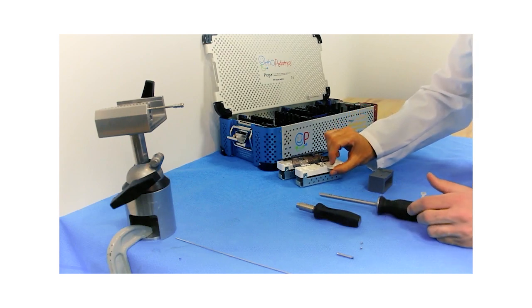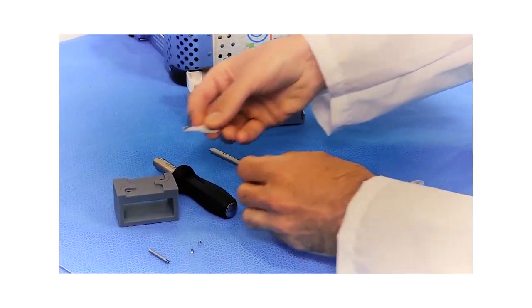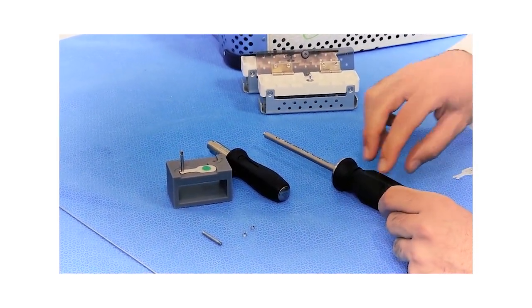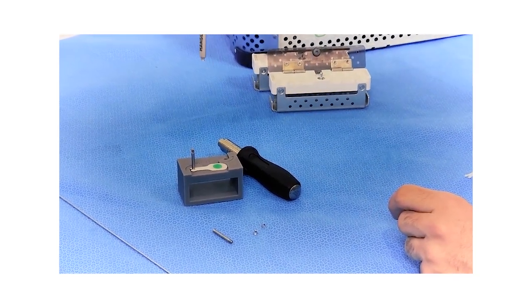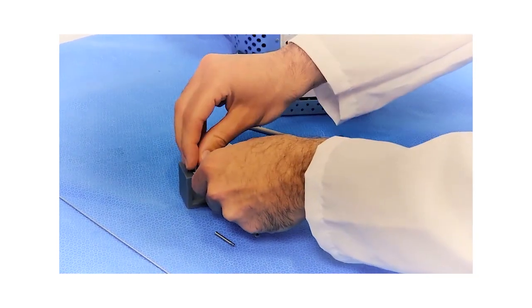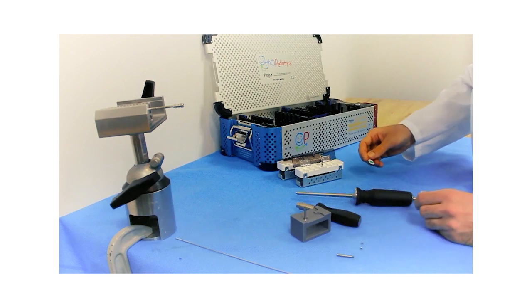Alternatively, the clip can be loaded in this assembly jig, which allows a stable placement of the cartridge, and then in a similar fashion, the handle is loaded onto the cartridge, rotated counterclockwise, and from this position the clip can be securely removed. The same assembly principle applies.